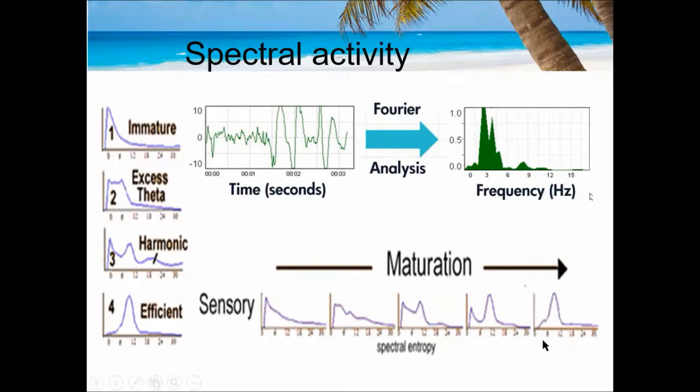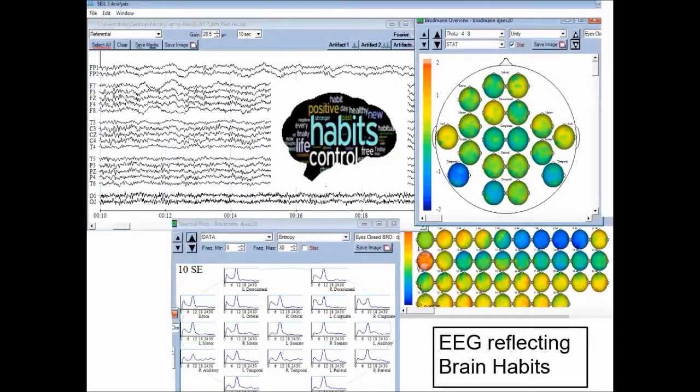That's what you want. In fact, if you saw that while someone was watching a movie, it means they're pretty bored. So you don't want to see that. In essence, this is a disengagement from the environment, but we've got to see it in the eyes closed condition. That's what we want. Okay, and there are a lot of EEG measures. In fact, the initial analysis in Skill 3 was 31 parameters. And many of the parameters, not all of them, would have frequency components, so theta and delta and alpha and beta and so forth, or single hertz: 1 hertz, 2 hertz, 3 hertz.